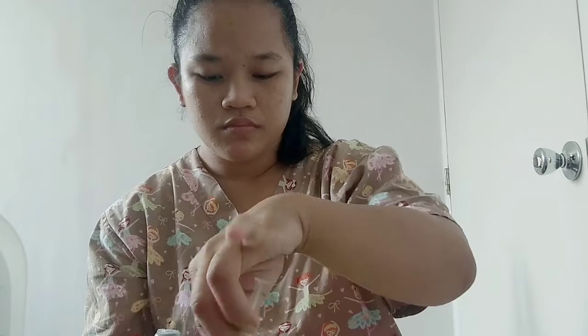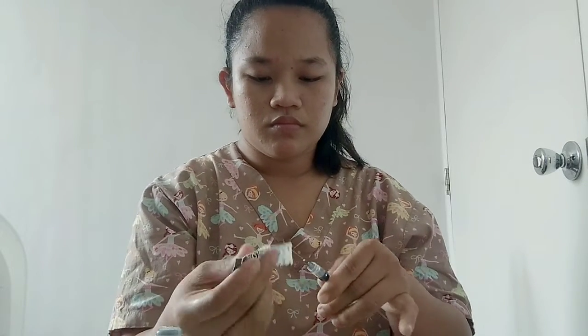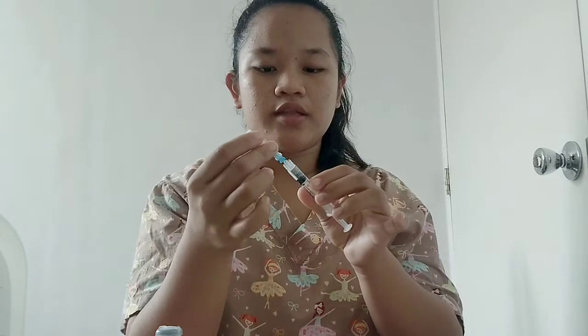The next thing we are going to do is remove this aspirating needle and put it in a proper waste disposal, and put back the original needle.